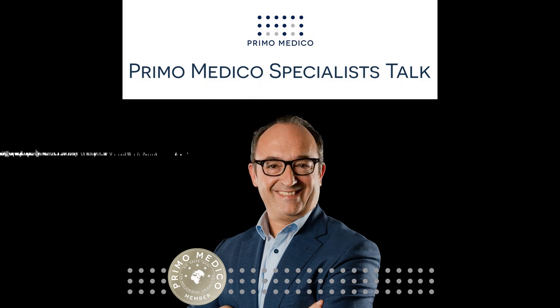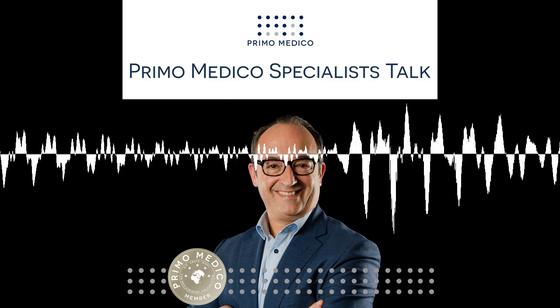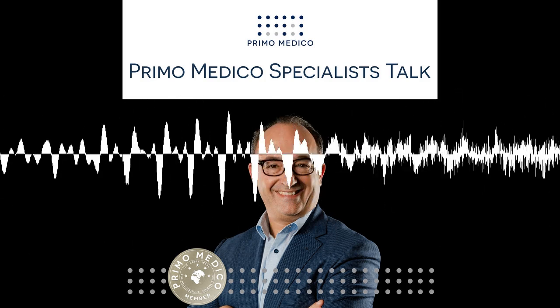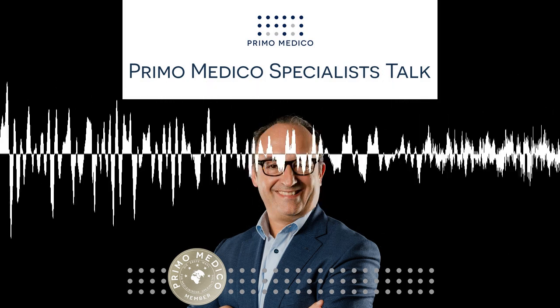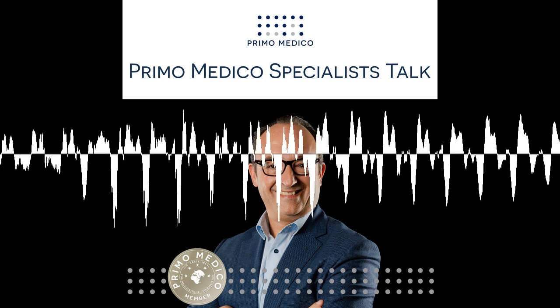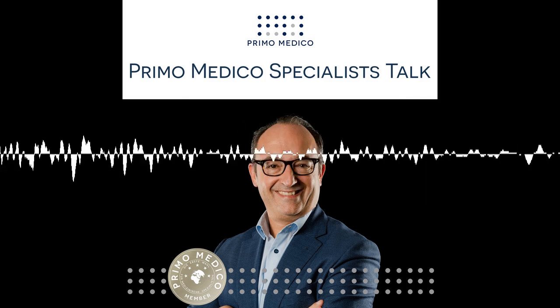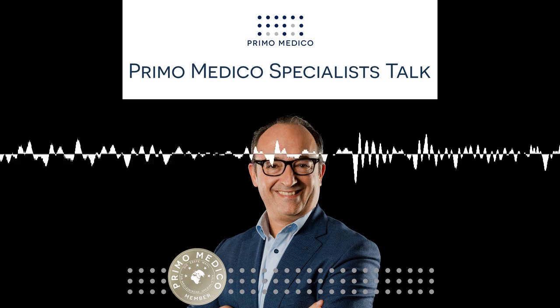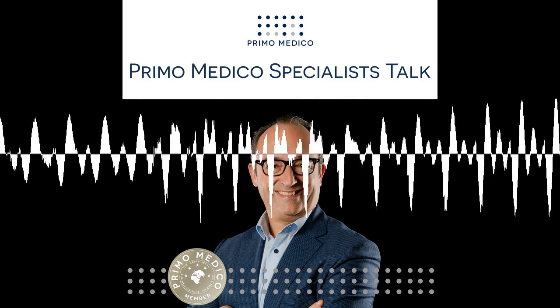Arthrodesis was always the traditional treatment of ankle OA. We fuse the joint in a way that what is not moving is not hurting. However, this is a problem because over the years, this fusion creates stress in the neighboring joints, and this then creates osteoarthritis of the neighboring joints. And then the patient has to get a new arthrodesis of the neighboring joint and so on. Total ankle arthroplasty also protects the neighboring joints.